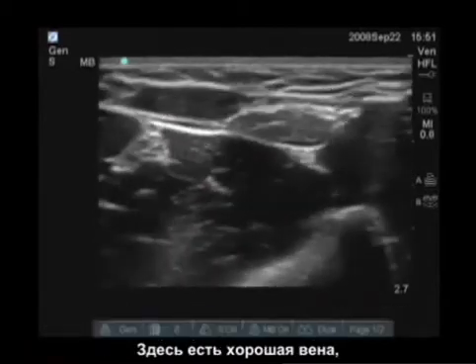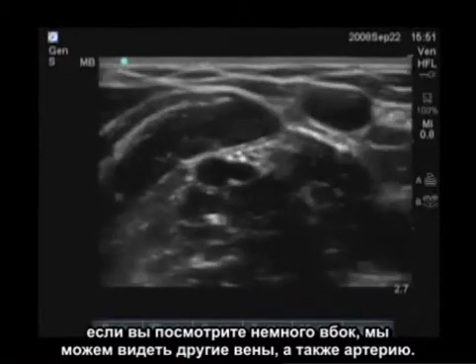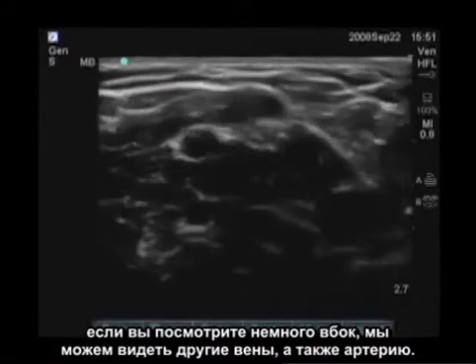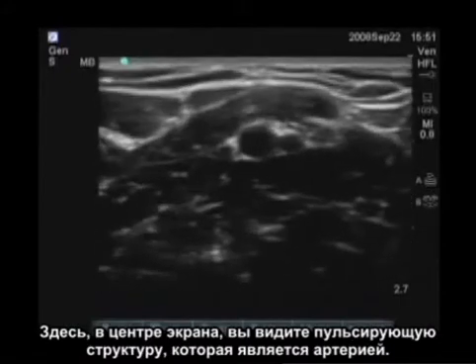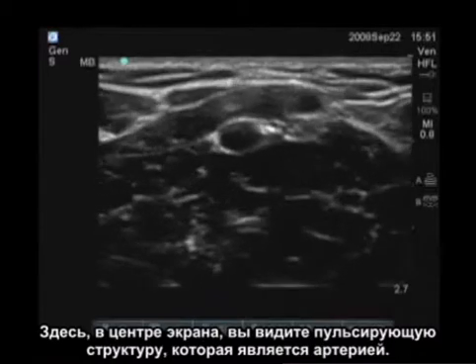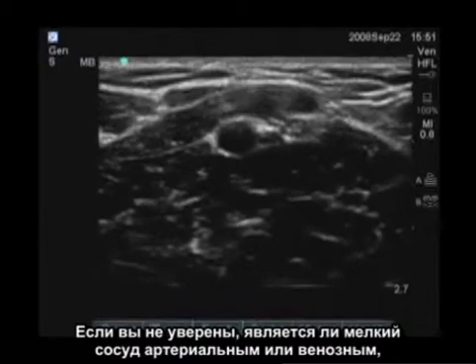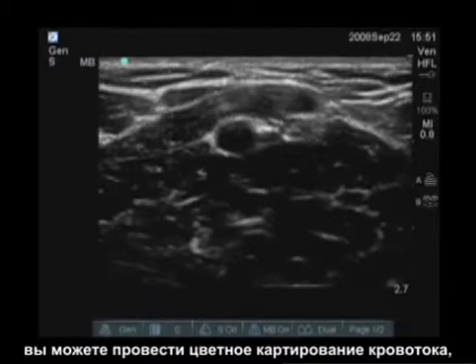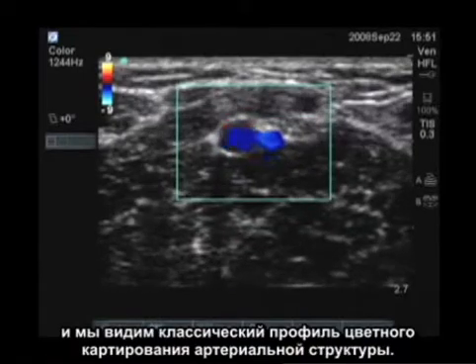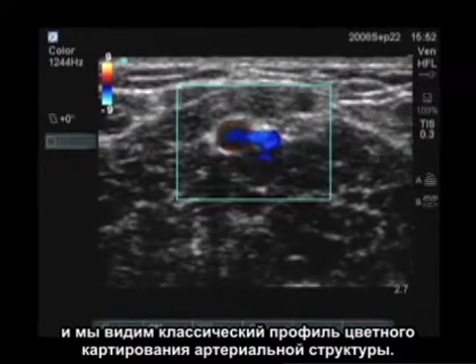This is a good vein here. Looking a little more laterally, we can see other veins and the artery as well. In the center of the screen, you see a pulsatile structure which represents the artery. If you're unsure whether a small vessel is arterial or venous, you can put the color flow on, and we see a classic color flow profile of an arterial structure.